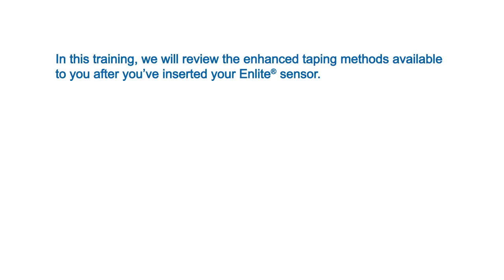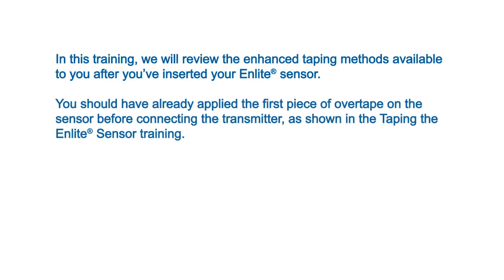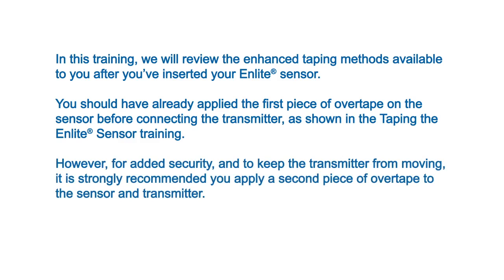In this training, we will review the enhanced taping methods available to you after you've inserted your Enlite sensor. You should have already applied the first piece of overtape on the sensor before connecting the transmitter, as shown in the Taping the Enlite Sensor training. However, for added security and to keep the transmitter from moving, it is strongly recommended you apply a second piece of overtape to the sensor and transmitter.